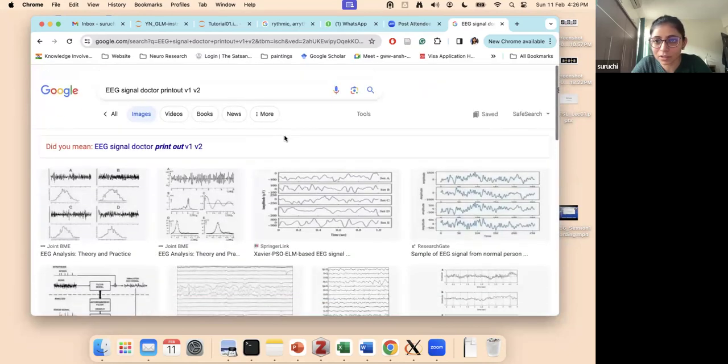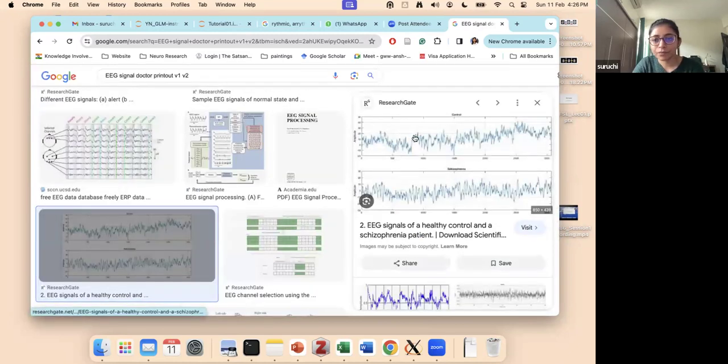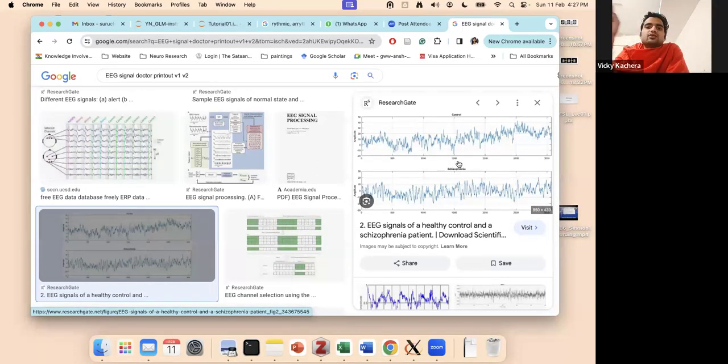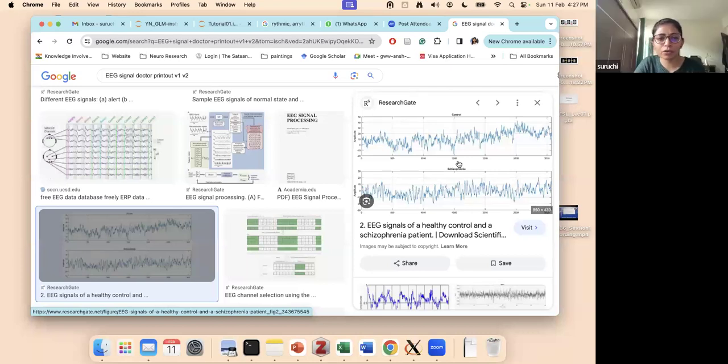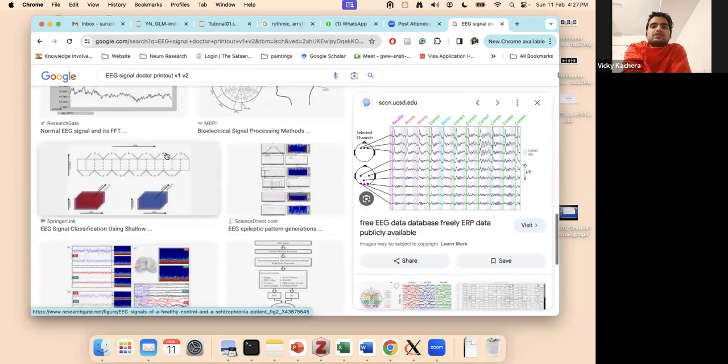I was trying to understand it, but basically it will have grids, and it will mark 1 second. So doctors can count the number of peaks in 1 second. Not only count, doctors are also trained to look for abnormalities. Normally doctors would do EEG for pathological conditions. They want to know if your brain is functioning properly. So maybe someone has a tumor or something like that, that can get diagnosed, and epilepsy for sure can get diagnosed.